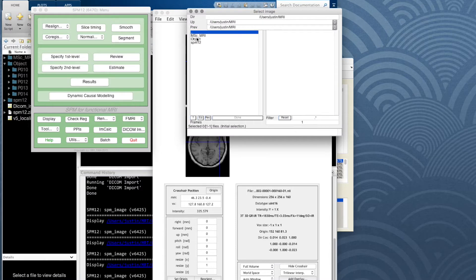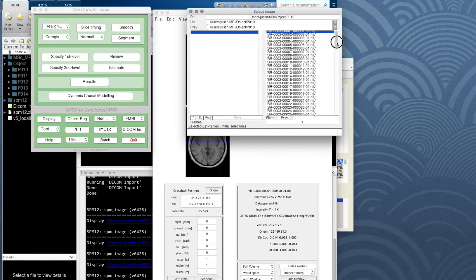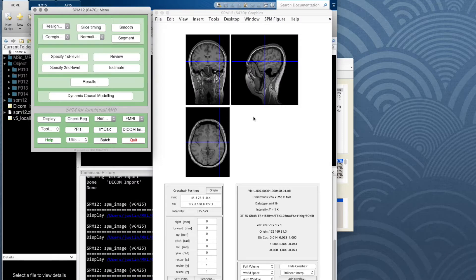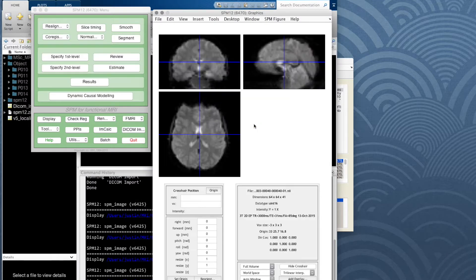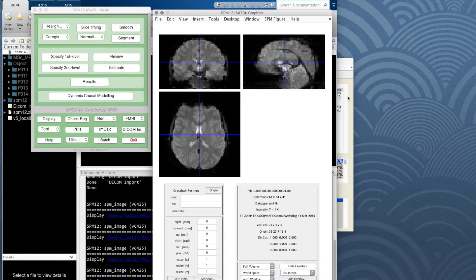We can also have a look at the functional images — just choose one at random. Have a good look at it and make sure it corresponds to what you believe it should in terms of voxel size, the dimensions, and number of slices — and that's all looking fantastic. Check that for all your participants to make sure you've got all the right data.